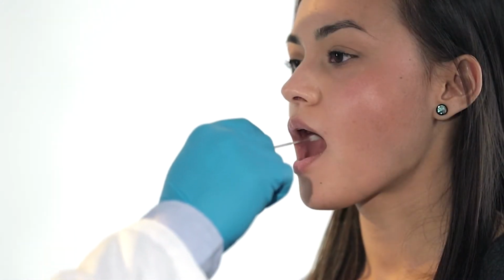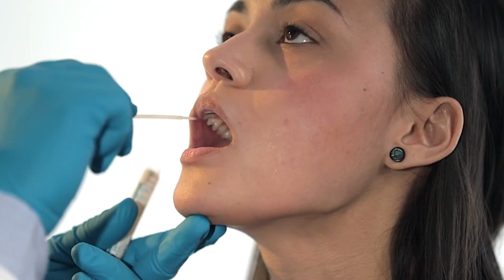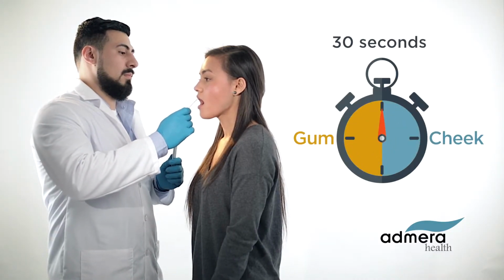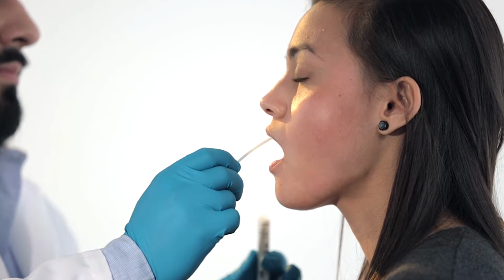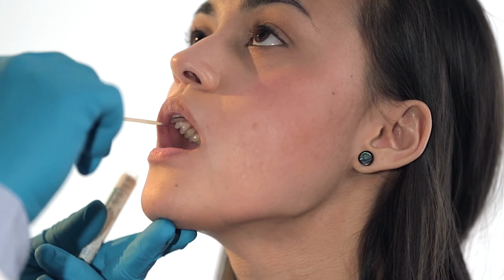With sufficient pressure, rub and rotate the swab, sweeping across the cheek and gum for a minimum of 1 minute, 30 seconds on the cheek and another 30 seconds on the gum. For best results, ensure the entire swab head makes contact with the patient's cheek and gum. Take caution not to touch swab head against patient's teeth, lips, or any other surface.